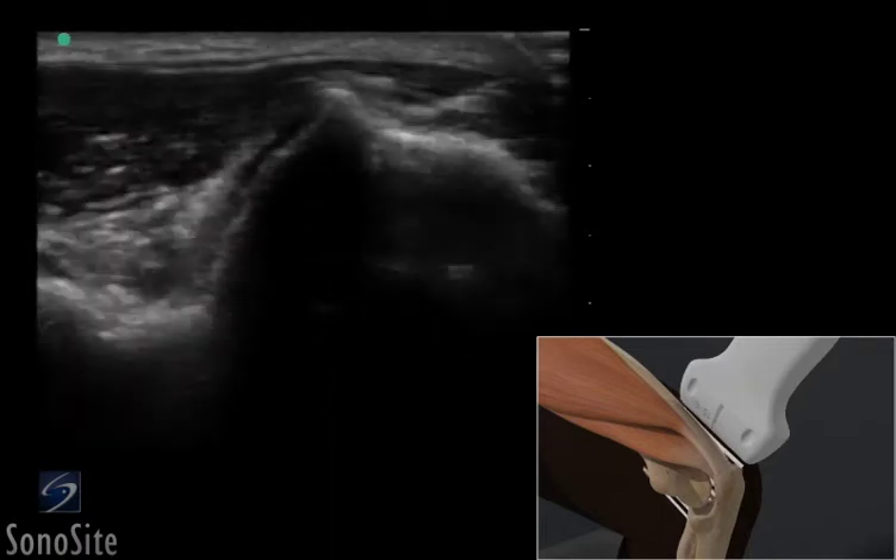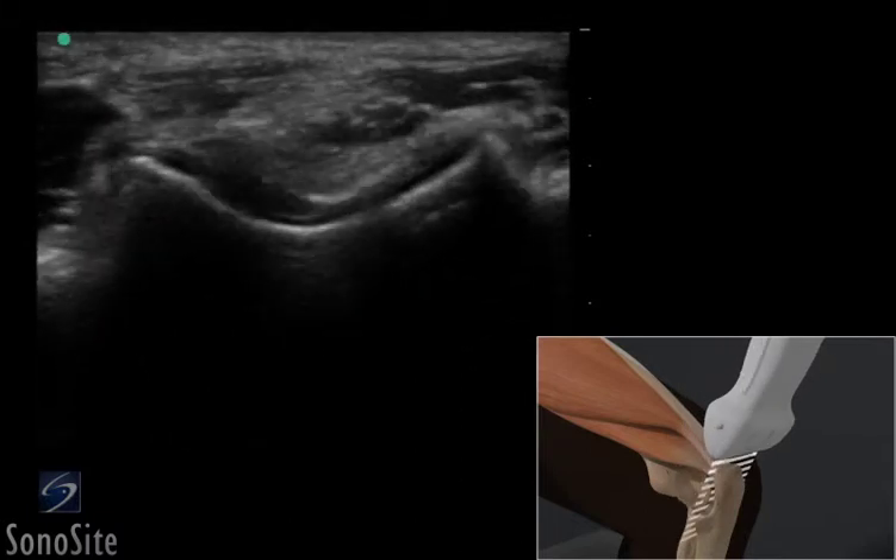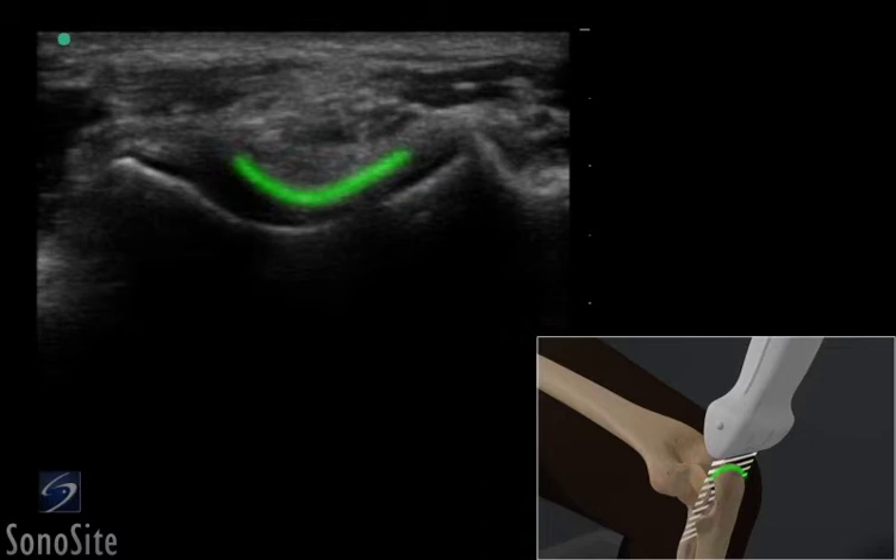The transducer is rotated 90 degrees counterclockwise with the orientation marker directed toward the patient's right side. The triceps tendon appears as a hyperechoic oval structure overlying the hyperechoic surface of the olecranon.